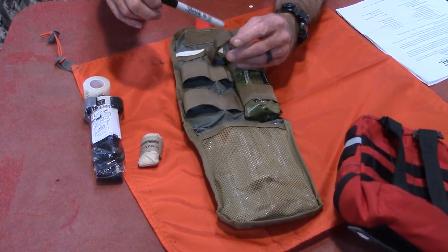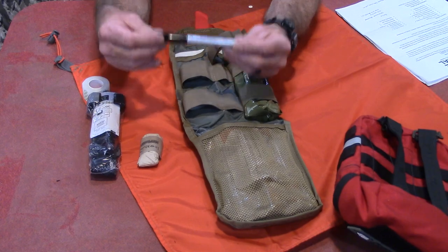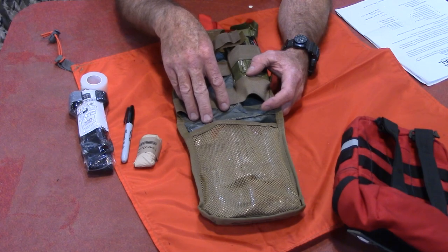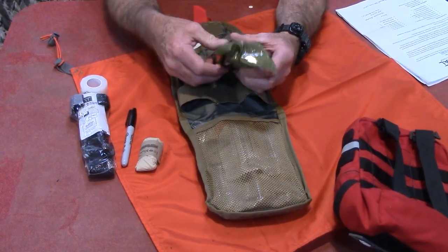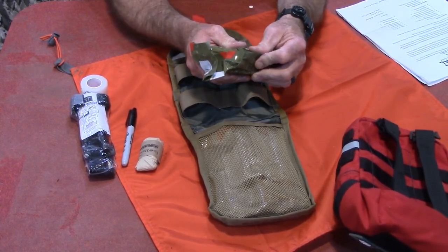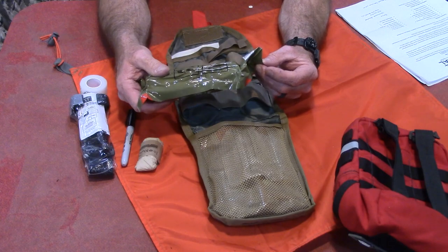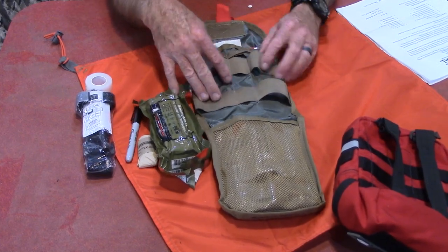I'm calling this more of a trauma kit than a first aid kit because there are no band-aids or boo-boo stuff in here — this is all designed to save your life. The next item is an emergency trauma dressing, similar to an Israeli bandage, a six-inch dressing from North American Rescue — the real deal. In the back pocket, we've got a good pair of trauma shears — autoclave NSN-numbered shears. They are made in Taiwan, not Communist China, so I can't fully claim USA-made there, but it's NSN approved and they're real quality shears.